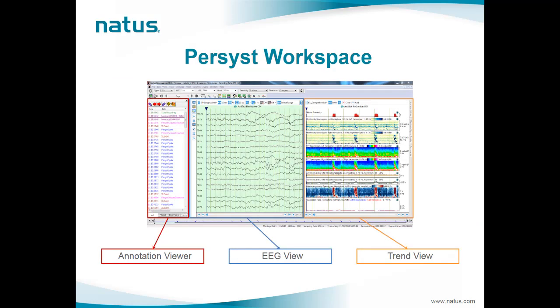The Persyst workspace is typically composed of three sections: the annotation viewer on the left, the EEG view in the middle, and the trend view on the right side. Users can customize the layout and save different workspaces. In the annotation viewer, all events collected during the recording are displayed in chronological order, including both EEG tech events entered by the system and user, and Persyst events such as spikes and seizures. Clicking on each event immediately jumps to that point in the EEG, shown in both the EEG view and the trend view as they are synchronized.